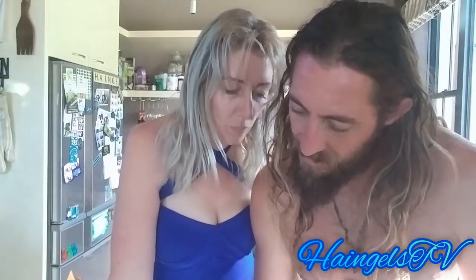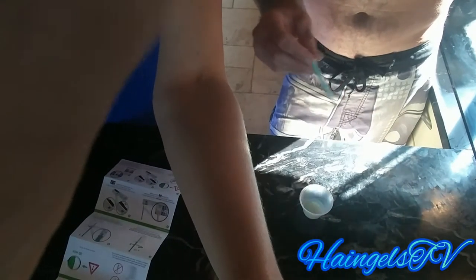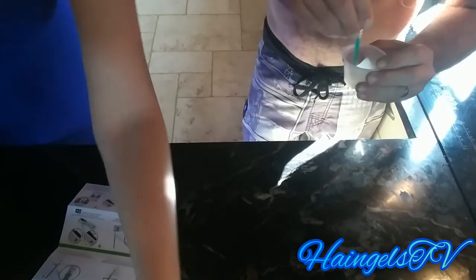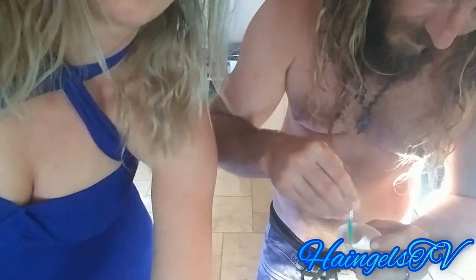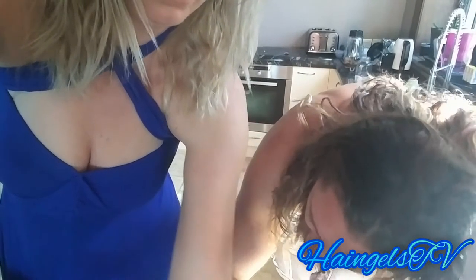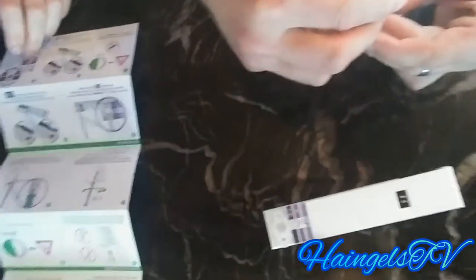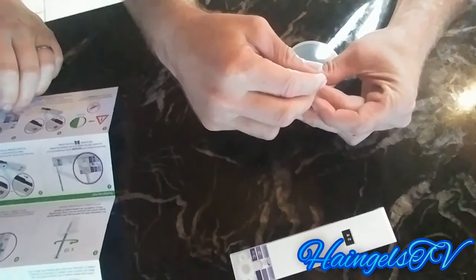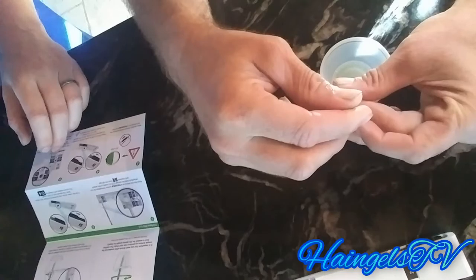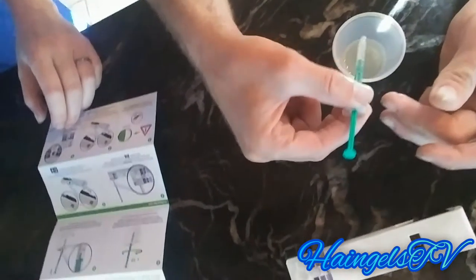It says stir 10 times, suck up 0.5. So let's do it around a bit. And then 0.5 — so where's that mark there? It says make sure not to get any air bubbles in there. So we've got that.